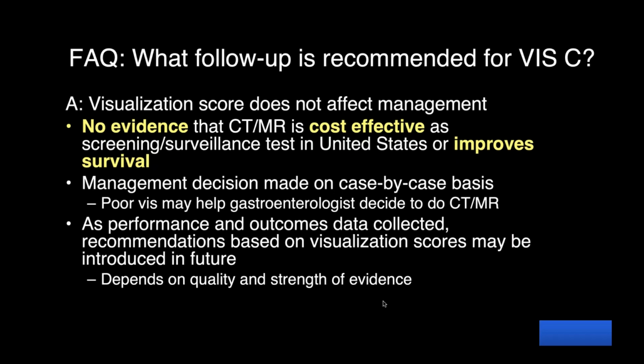One thing that a lot of people ask is, what should the recommendation be for patients who have visualization C exams? It really leaves us feeling quite uncomfortable to just give a visualization C and not say anything further. Especially as radiologists, we want to give some sort of recommendation. So it doesn't quite settle well, and I can understand that feeling, and I acknowledge that.